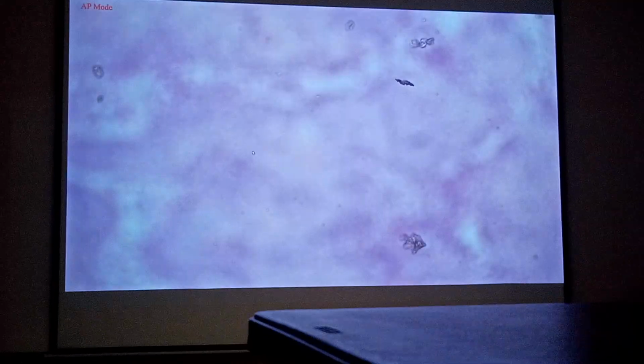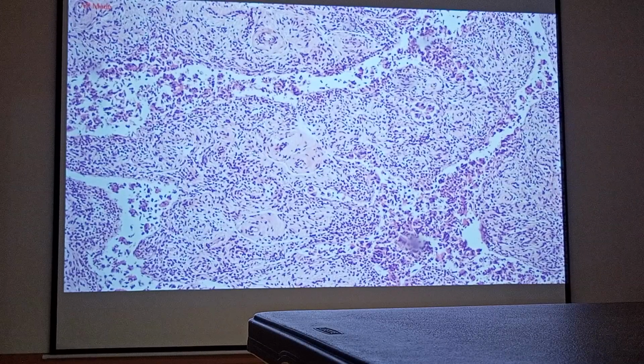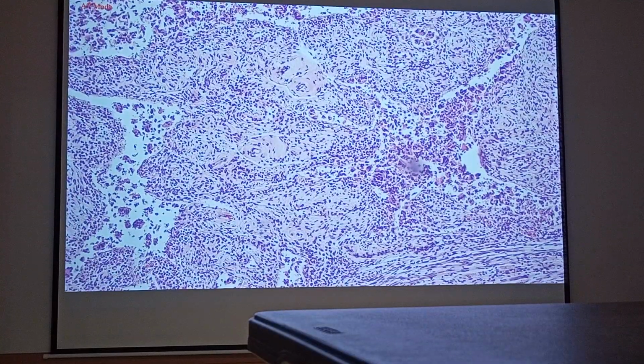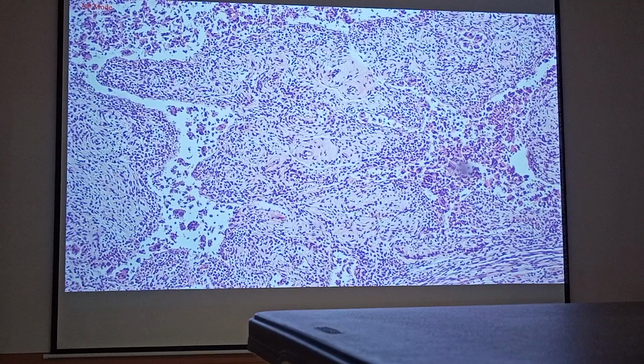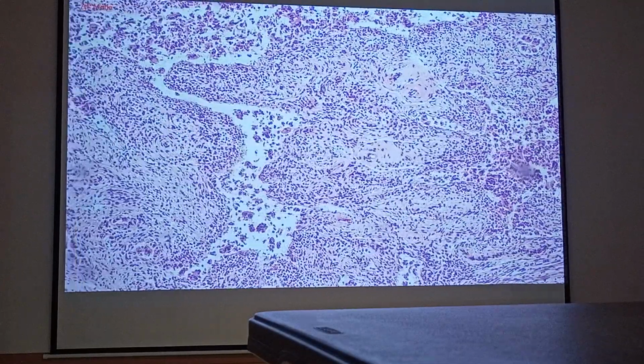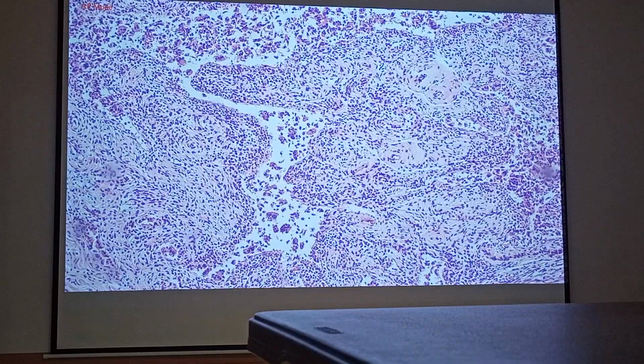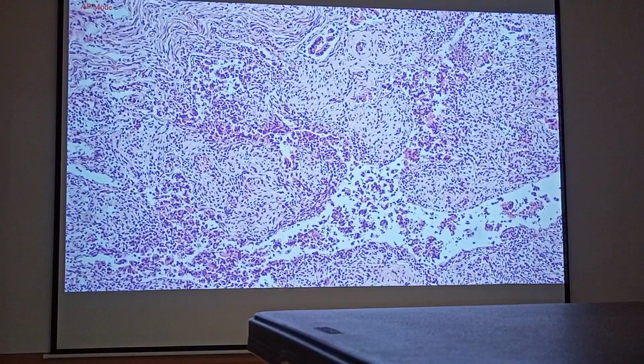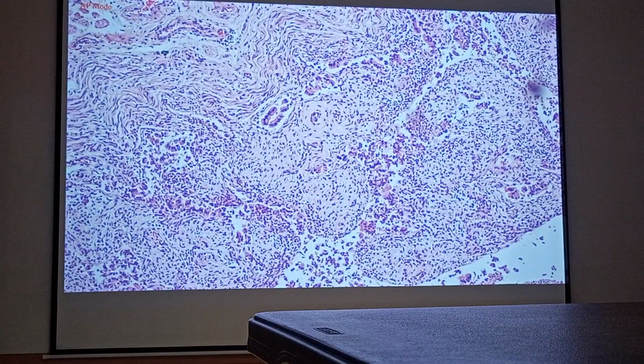And then when you shift to higher magnification, you will be able to see that the dots are actually composed of neutrophils. Okay? So there is acute inflammation that has developed in the mucosa of this fallopian tube, and because of the neutrophils performing phagocytosis, there will be leakage of the contents of their lysosomes, causing the destruction of not only the lamina propria, but also the epithelium covering the lamina propria. That is why majority of the surfaces of the mucosa are not anymore displaying the usual simple ciliated columnar epithelium. That epithelium has been liquefied already by the contents of the lysosome of the neutrophils.